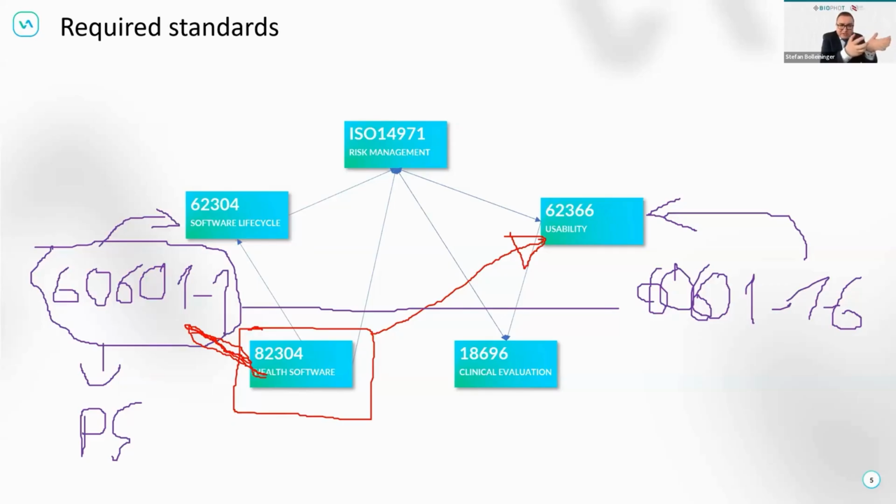So that's the problem with all that kind of connected standards. You have the ones which are software as a medical device, which are process related, and then you have the other ones, the 60601-1 series and all which is behind there, and that one is outcome related or technical related. That's because for a physical device, it is easier to be controlled than utilizing it on a more vague basis. The software as a medical device standalone, including AI, is more vague, and in that case it is easier to control it by a process than controlling it on an overall system.